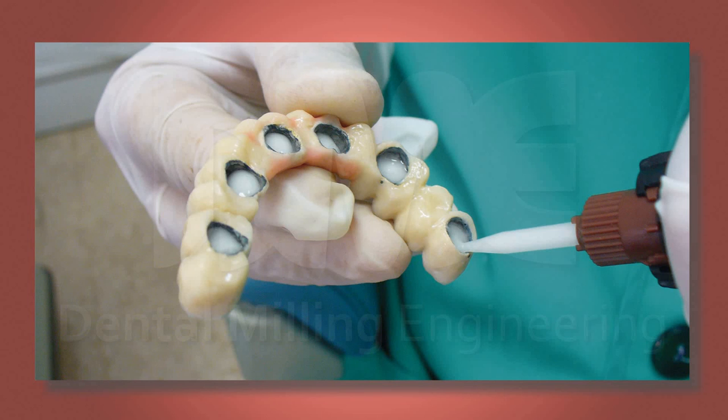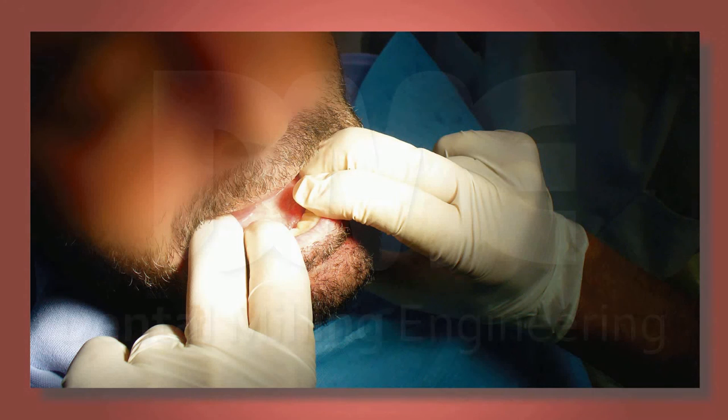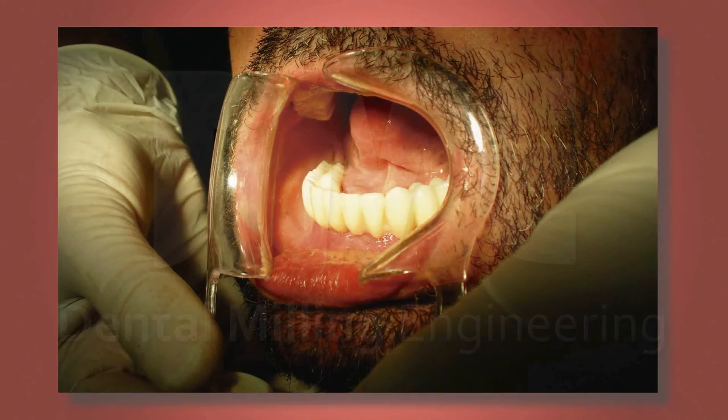It is very important and advisable, when placing the cement into the prosthesis, to not fill the cavities to the maximum. The prosthesis is screwed manually, preventing the patient from biting his own prosthesis. A passive fit is always guaranteed by manual clamping. An eye check is performed to see the fit of the prosthesis to the gum.